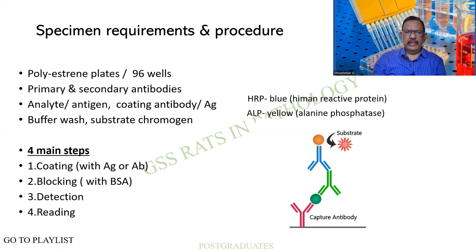So what will happen is the substance and the antigen are being coupled together, or the antibody and the antigen are being coupled together, and they are being washed with a buffer. And if it is going to be an adherent substance, it will remain, whereas all the non-specific ones are getting washed off. These are later on measured or identified by means of a substrate or a chromogen.